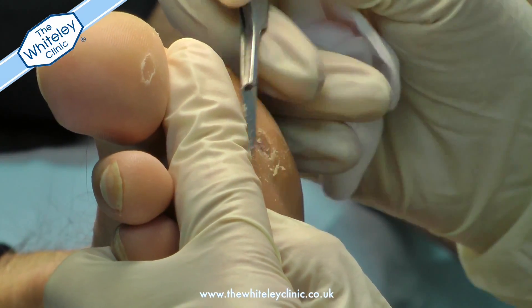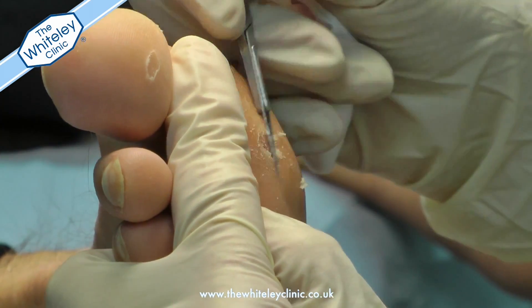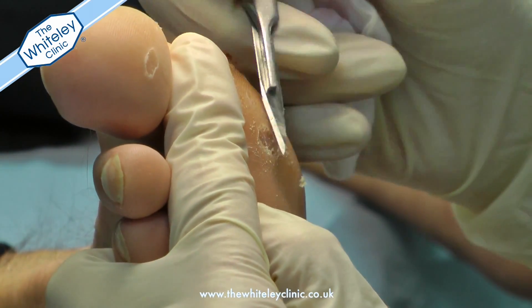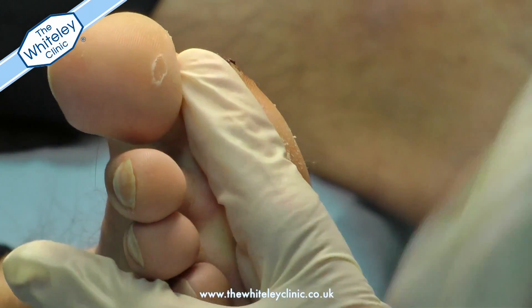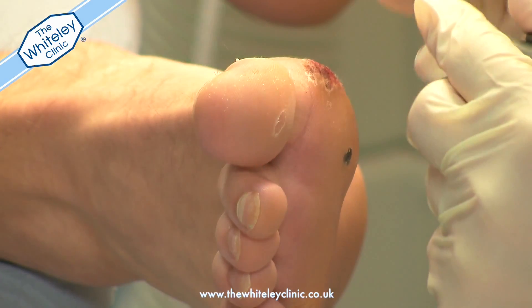Occasionally, when you are removing the hard skin, some of the small blood vessels known as papillae come to the surface and this can cause a small amount of bleeding. Once the hard skin has been removed, the laser is then used in conjunction with the cryo machine.